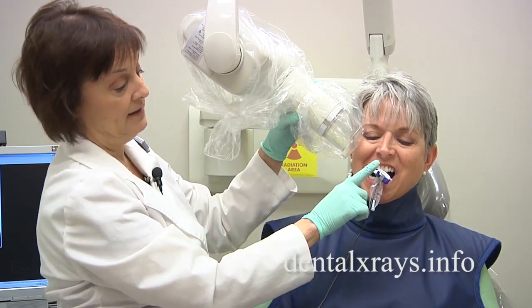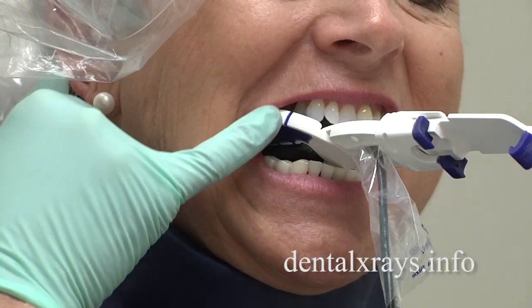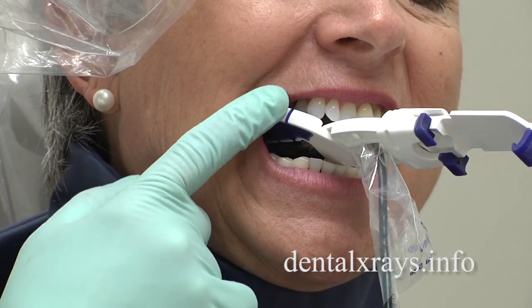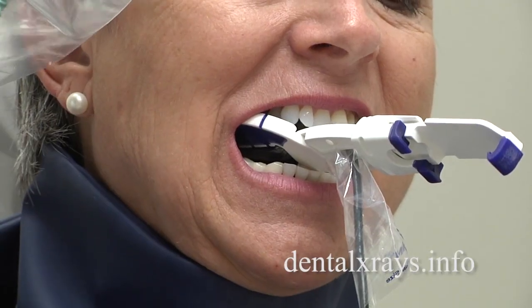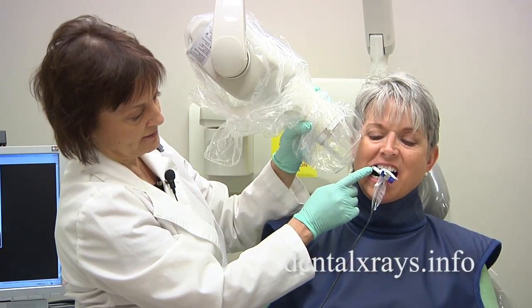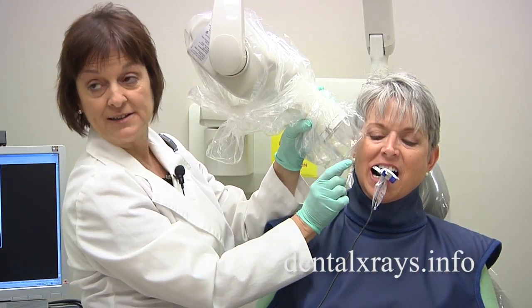There's a little purple line on these particular pieces — you can see that? That's indicating where the front edge of your sensor is in the mouth. If you bring the cone right to this purple line, you won't be missing the front edge of the sensor.